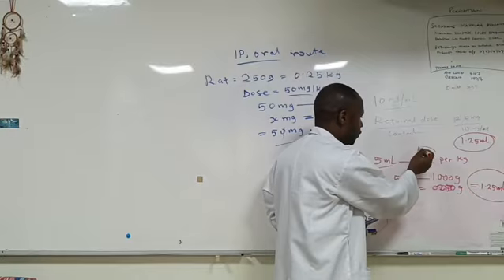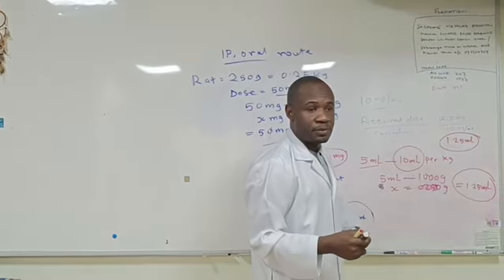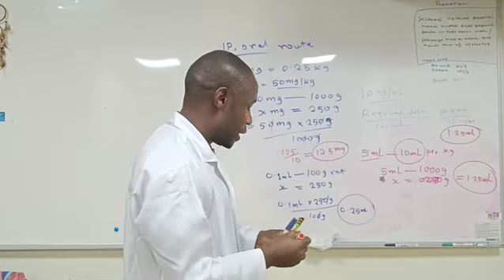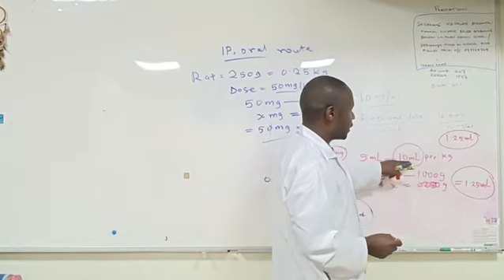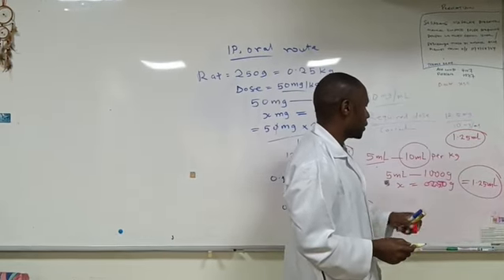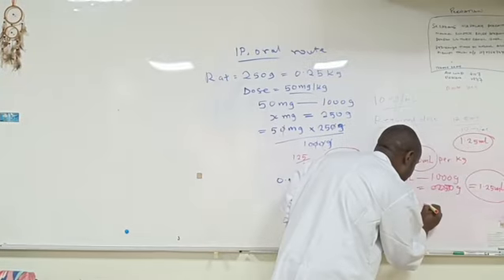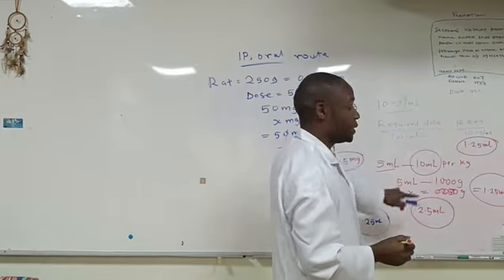Some will go up to the higher value. That is in a situation where the dose is not specified. It has been prepared, then you have to administer it to that particular rat. So you now consider taking between this and this. If we are taking the higher one, meaning we are going to give 2.5 ml to this particular rat, but this is the maximum.